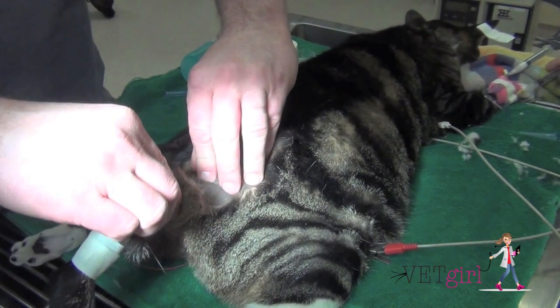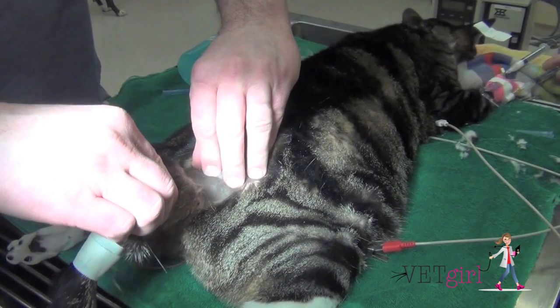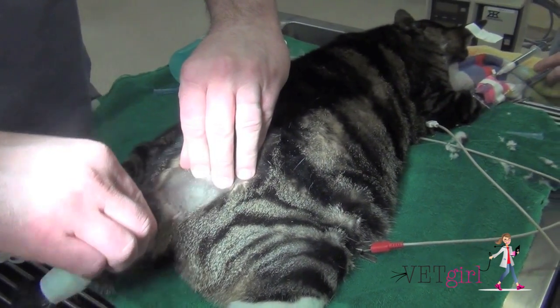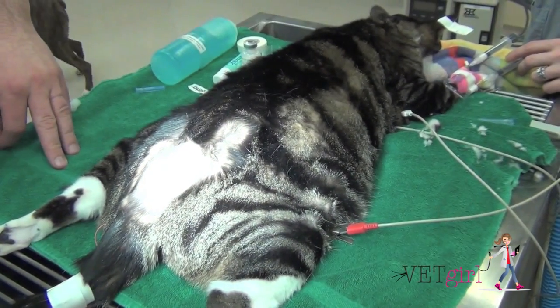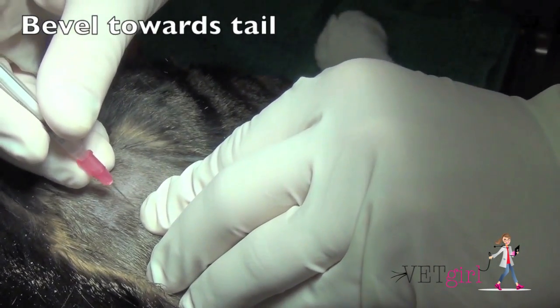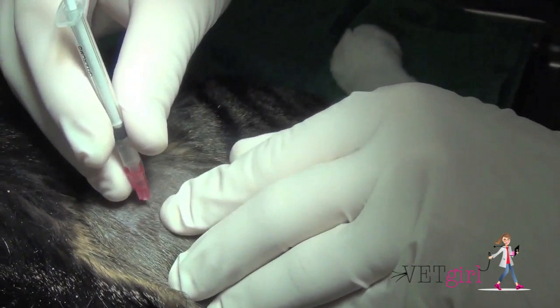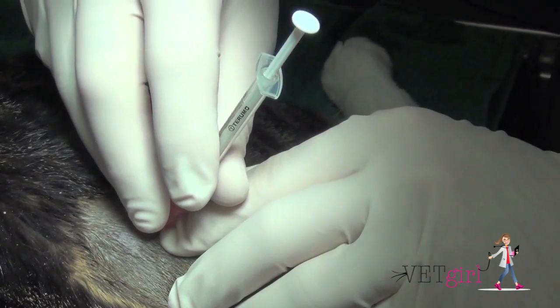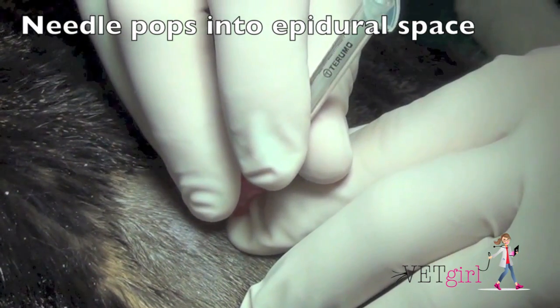By flexing the tail dorsally, you'll notice that there's a little divot, and that's the main area where we're going to aim for. We're going to use a 25-gauge needle, one inch, and direct it at a 30 to 40-degree angle midline, using a preservative-free sterile new container of 2% lidocaine, at a dose of 0.1 to 0.2 ml per kg.